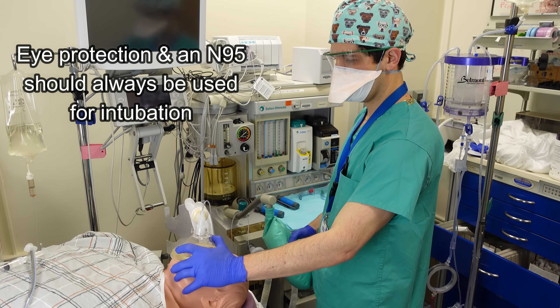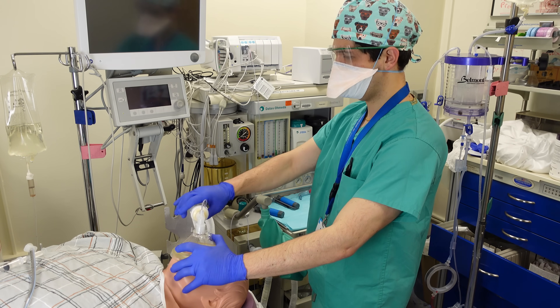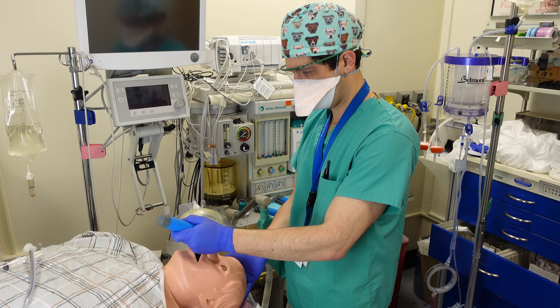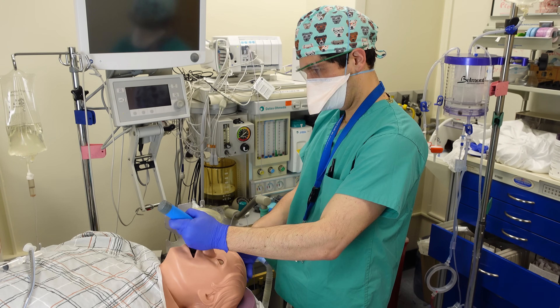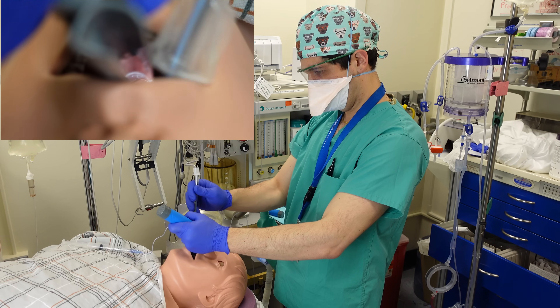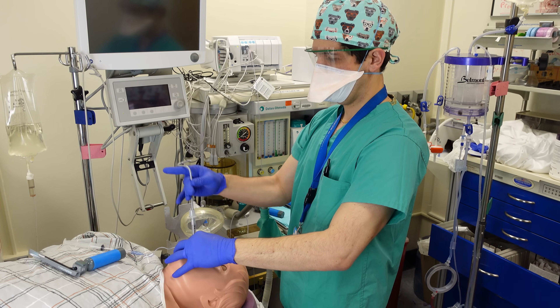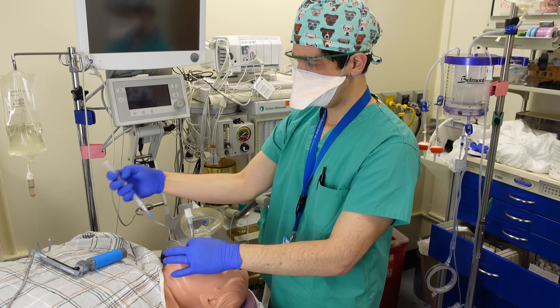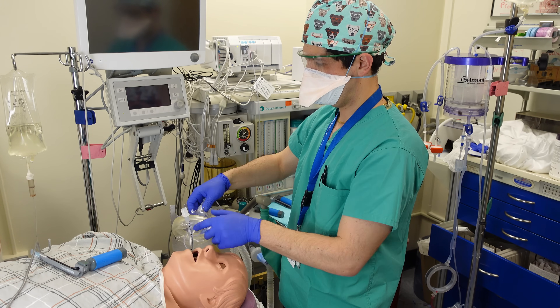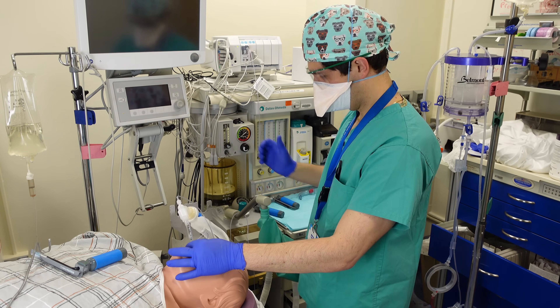Before I break down the steps for an intubation I want to just show you what it all looks like. I'm starting by pre-oxygenating a patient who's already under general anesthesia. I'm tilting their head back, inserting the Miller straight blade in the right corner of the mouth angled towards the midline, finding my view of the vocal cords, inserting the endotracheal tube, watching it pass through the vocal cords, sliding out my stylet, inflating the cuff on the endotracheal tube, connecting my endotracheal tube to my circuit, being careful not to pull out the tube before it's been secured, and then confirming proper placement of the tube.